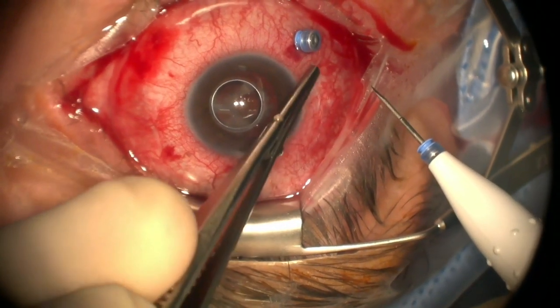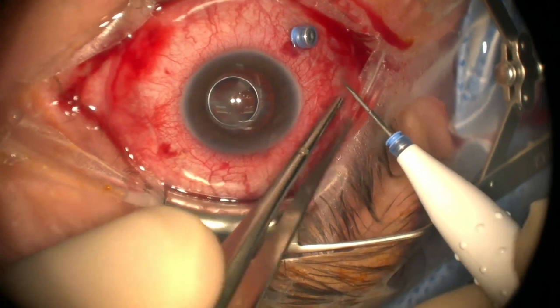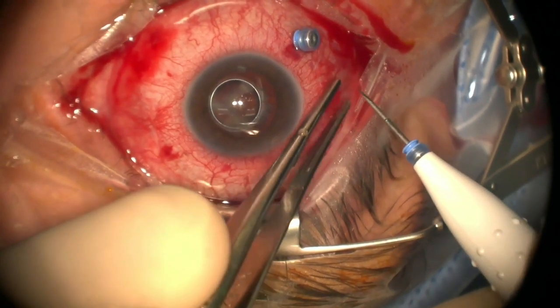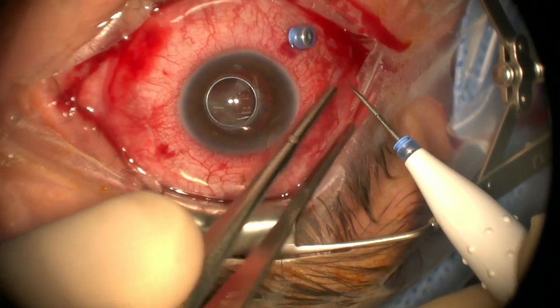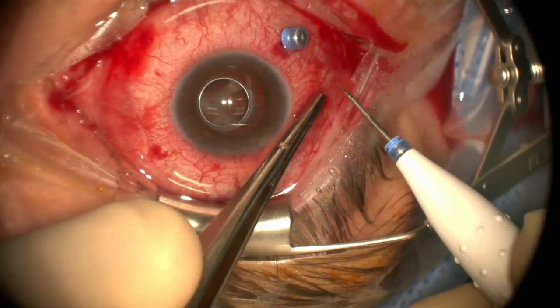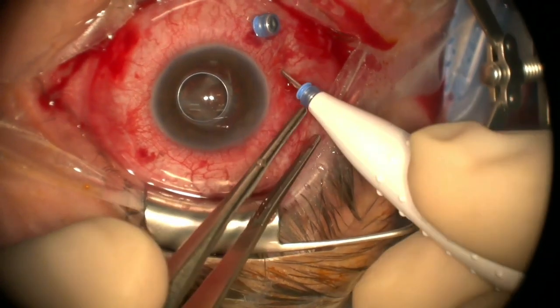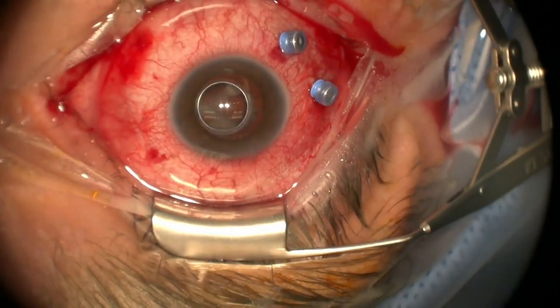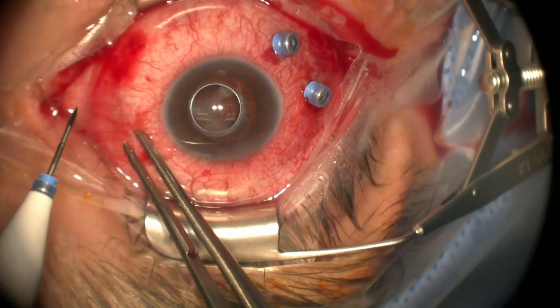We're not going to get the conjunctiva to move too much in this area. That's kind of a shame. But I don't want to use the old wounds. Their wounds were probably high. Yeah, they're high. I agree. So we're going to stay down near the horizontal, even though the conjunctiva isn't dislocating for me quite as much. I really don't like to go near old wounds. They spread, they leak, they're problematic.